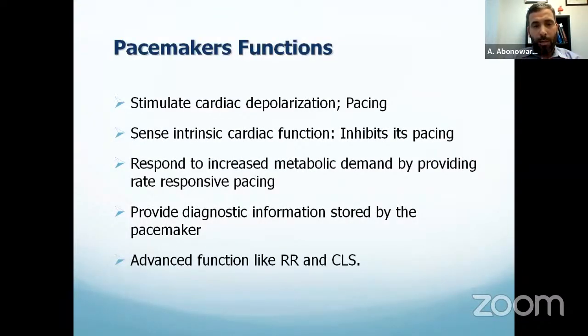So just to go back to the basics of pacemaker function. Pacemaker function is not only giving pacing to the heart and that's it, but it, number one, stimulates the cardiac muscle and causes cardiac depolarization, and we call that pacing. Also it senses the intrinsic cardiac function, so it actually inhibits itself. You may have a pacemaker that's sitting there and it's not pacing; it's working, it's watching. And that's because of this function, it inhibits itself because it's on demand. It's not like the very old pacemakers when you had to continuously pace the heart regardless. All the new pacemaker systems are on demand. So it inhibits itself when necessary.